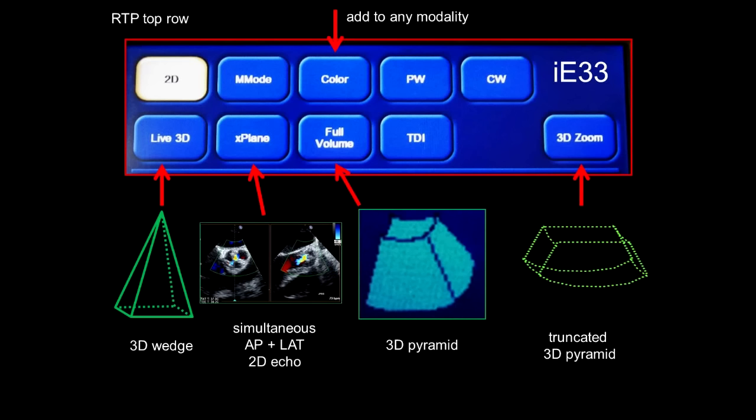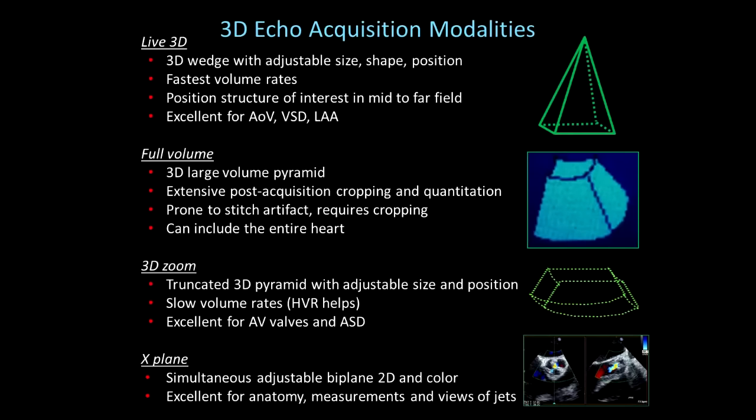There are 4 acquisition modalities. They are chosen from the right touch panel in the top region, and they include Live 3D, X-Plane, Full Volume, and 3D Zoom. We'll talk about all of these in sequence and in detail. Each has their own strengths, limitations, and best applications. They're chosen simply by touching one of the icons in the right touch panel.